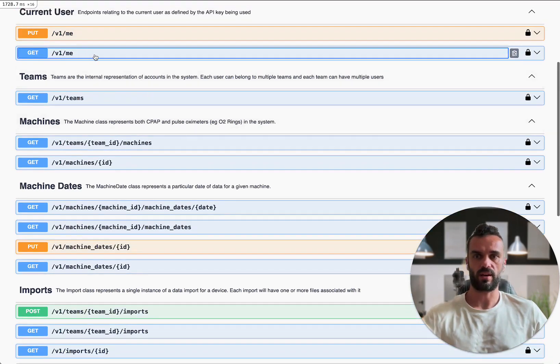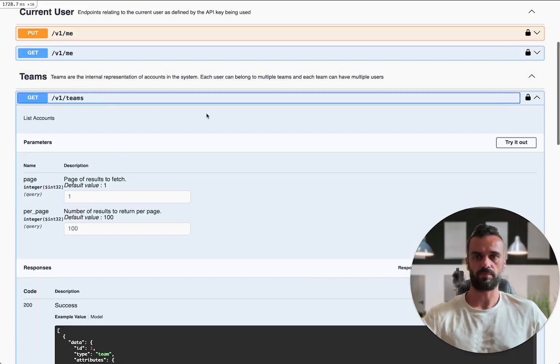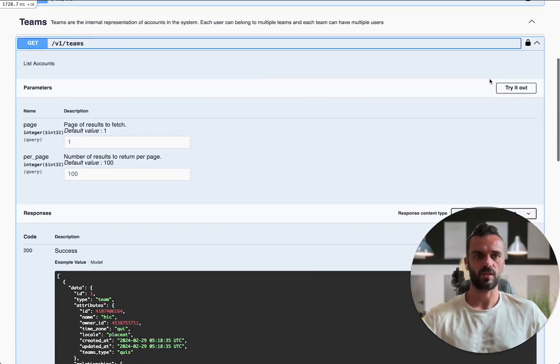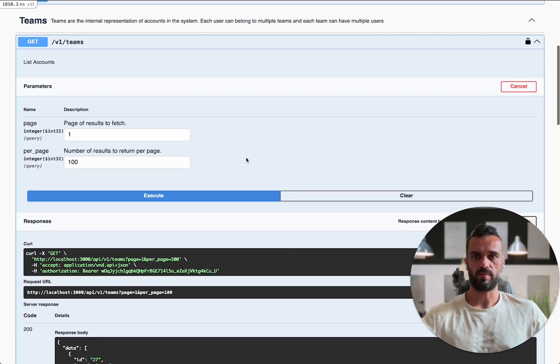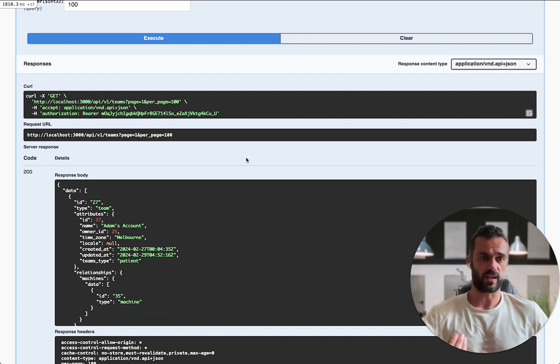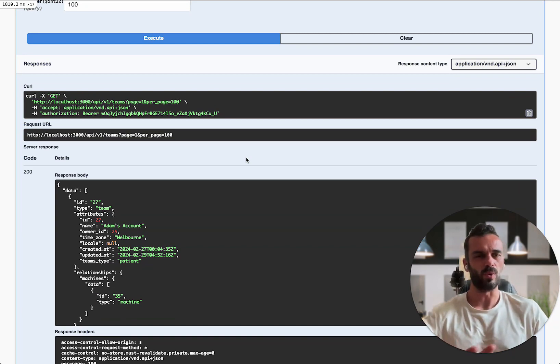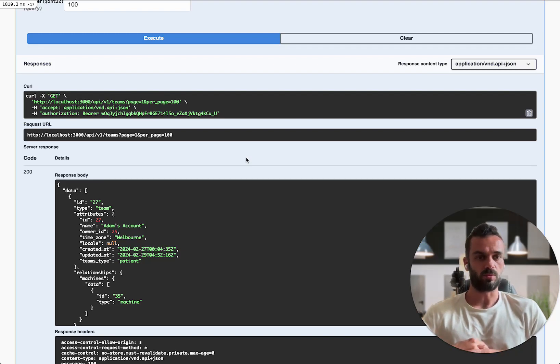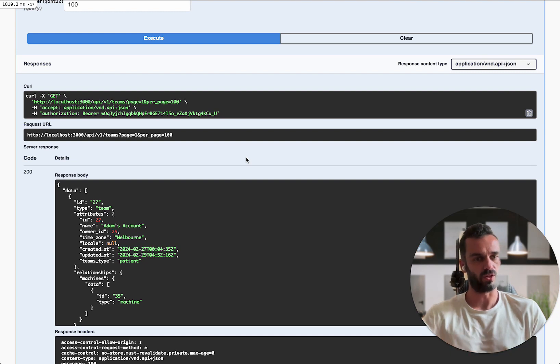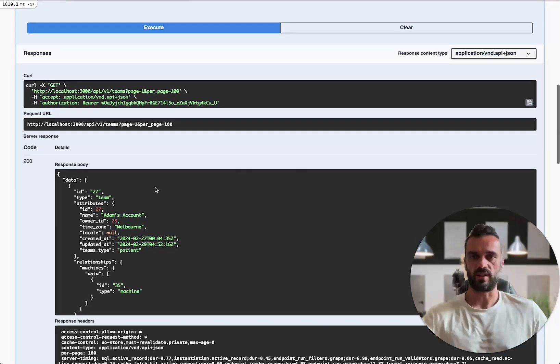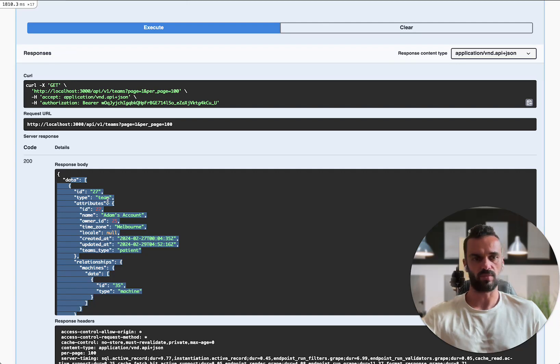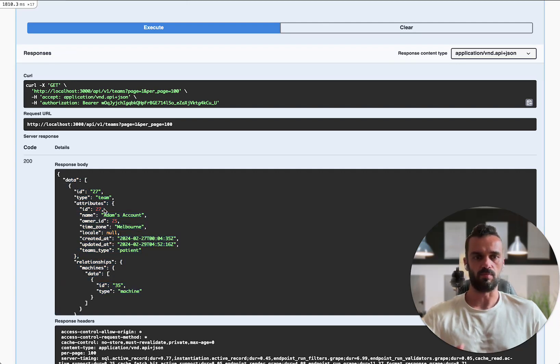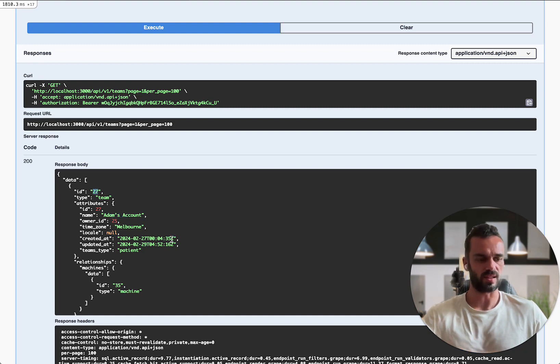I can get that from the me endpoint or I can also get it from the teams endpoint here. So when I run this one, it's going to give me back an array of all the teams that I'm associated with. A team on SleepHQ is effectively like an account. We call it a team behind the scenes, but we generally refer to them as accounts in the UI. You may well have multiple accounts that you're associated with because you might have been invited into other people's accounts. Most people will only have a single account and so that's what's happened here. I've run this endpoint. I've got back an array with just a single data point in there, which is my main account. It's called Adam's account and I can see the ID is ID 27.